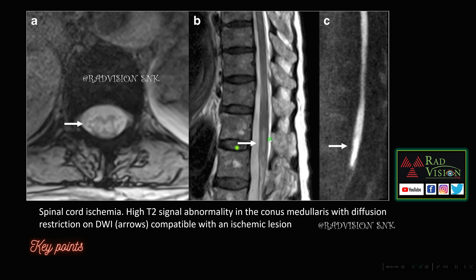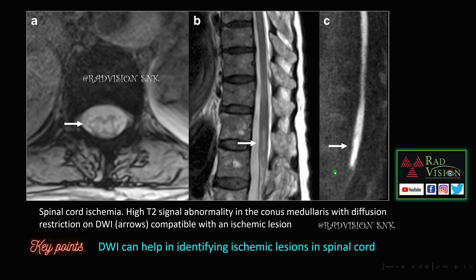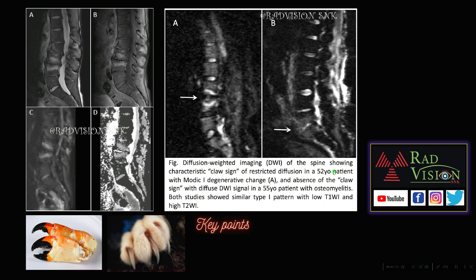Next: this was a case of spinal cord ischemia. You can see hyperintensities in the spinal cord on T2, showing classical restricted diffusion on DWI. DWI helps in identifying ischemic lesions in the spinal cord.